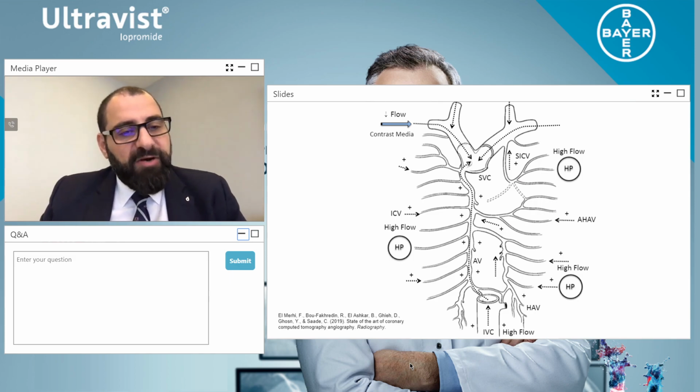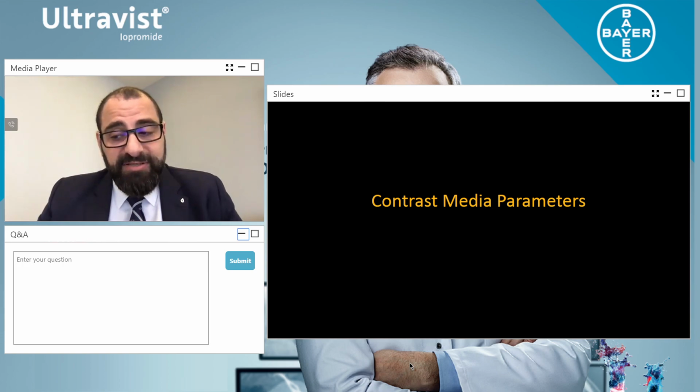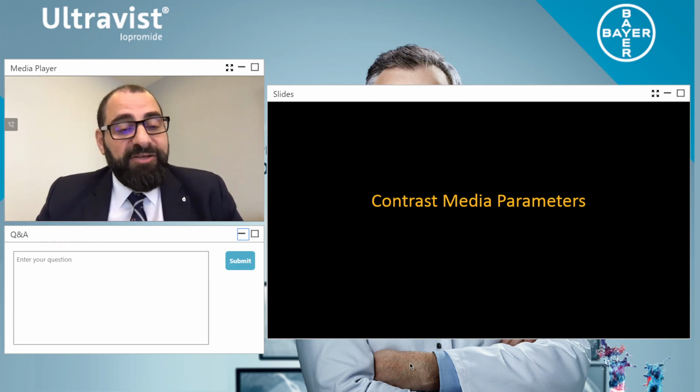So does anyone have any questions about that? I have the Q&A open, but I'd like to really understand this, because the reason why I went through this is because 90% of a lot of failed contrast media delivery strategies is because of breathing. And it's important always to spend a little bit of time with your patients, just to explain it to them. Make sure you have your mouth open when you breathe in, make sure it's very soft and doesn't have to put a lot of air in. And this will not affect your contrast media delivery.